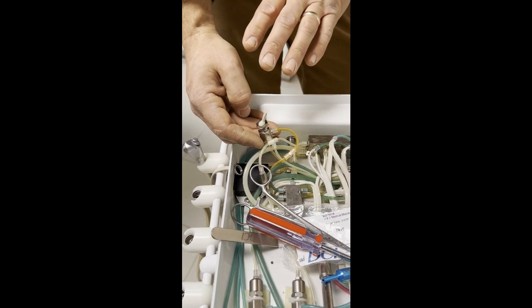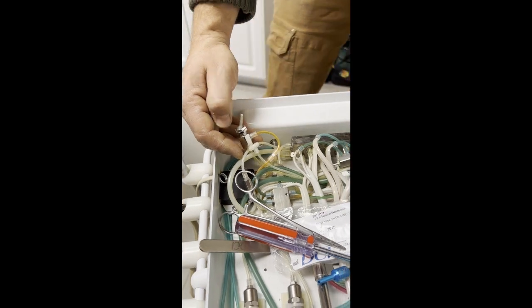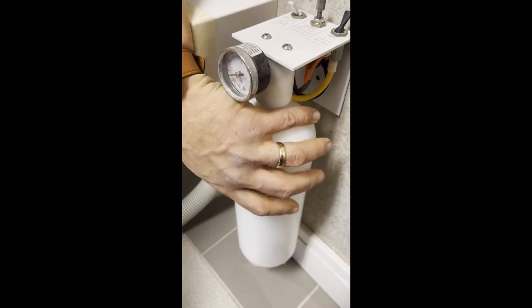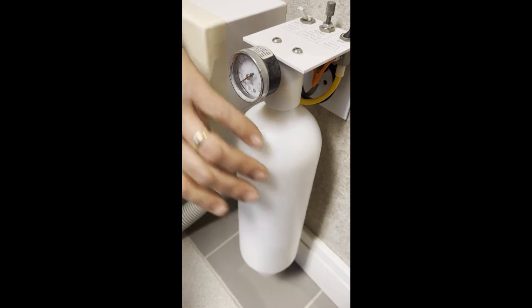Okay, the reason that's venting right now, like it was, is because the bottle system right over here has pressure on it. So we'll spin the bottle like in a dental kind of way, and that will make the noise stop up here.